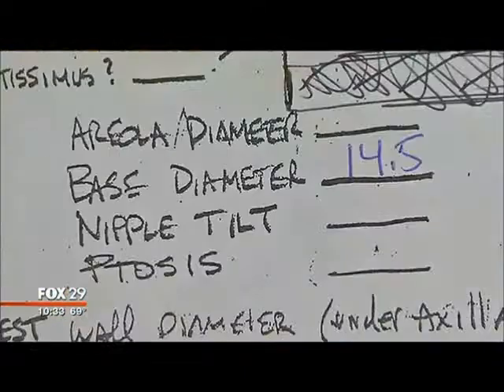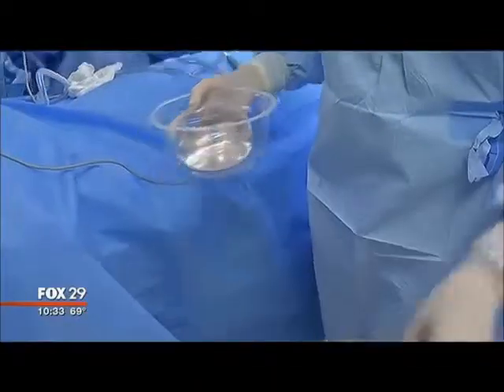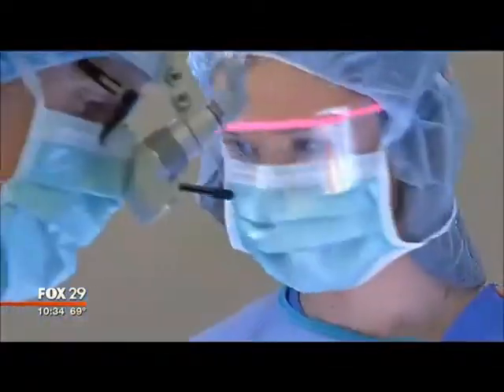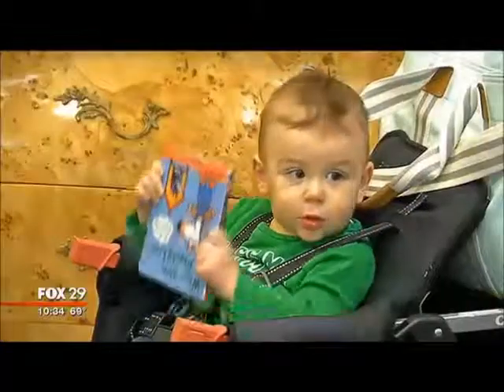So she is sized up and marked up. The doctor figures it'll take about a 500cc implant to fill the bill. You could really see the size difference once one implant was placed and when we compared it to the other side. The trick, he says, is to keep it looking real. We actually used a sizing device to show what really would fit perfectly. I think she's going to really love it.